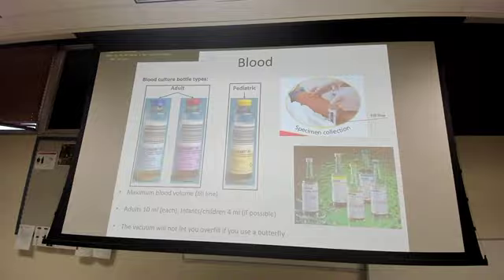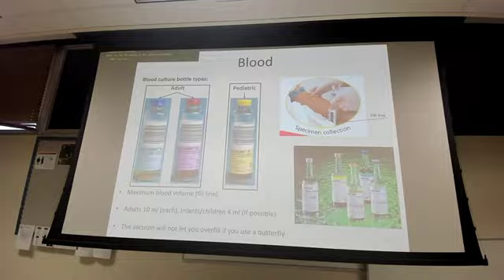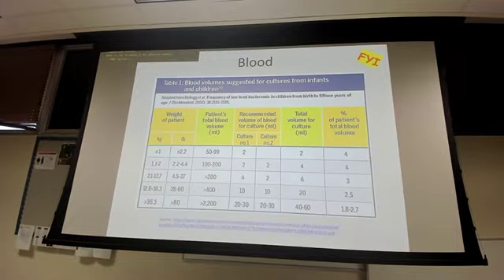You said we're taking 2 from each arm? Correct. They have 2 sets, right? So you're going to have an aerobic and anaerobic on one arm, and an aerobic and anaerobic on the other. I imagine there's a reason for taking from one arm and the other arm, and I probably need to research that for you, but I will write it down. It's for contamination. Different sites, so in case you have contamination over here, you still have a good set over there, and if you do pop positive on both, you know which bacteria it is. There you go. This is just FYI, a guideline that is currently being used. You will not be tested on this.